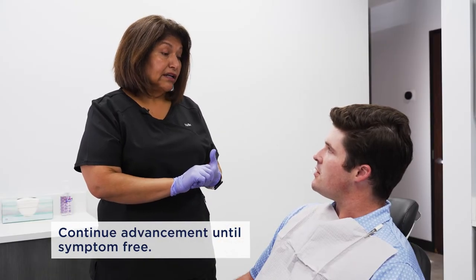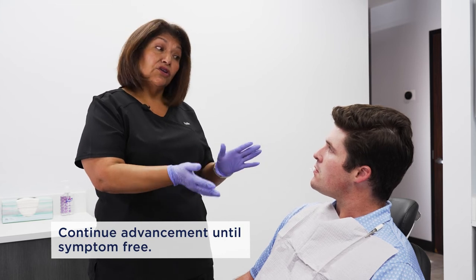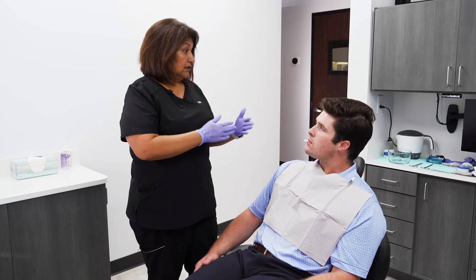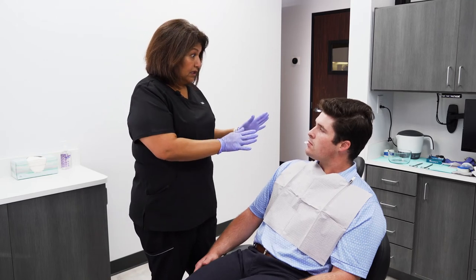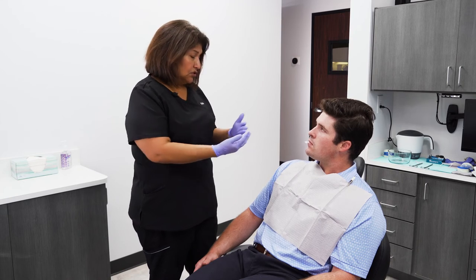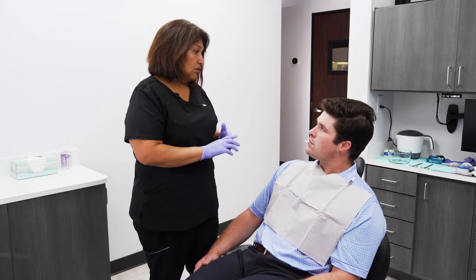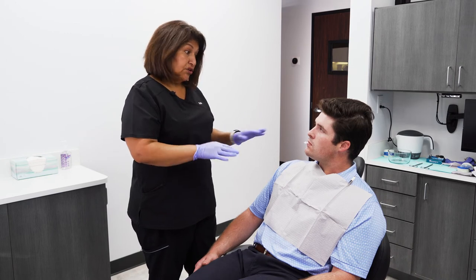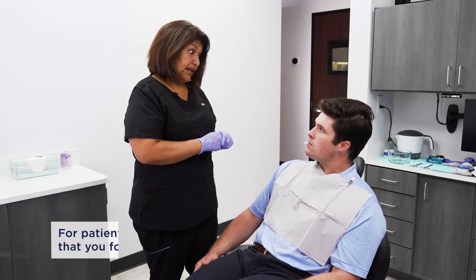And then we can go from there. Anytime you have any discomfort, you can dial it back to relax the jaw a little, and then let it rest for a couple of days, and then pull it forward again. So you just kind of listen to the jaw and to the muscles. Don't overextend it too quickly. Once the snoring is gone, you do not have to adjust it any further than that.